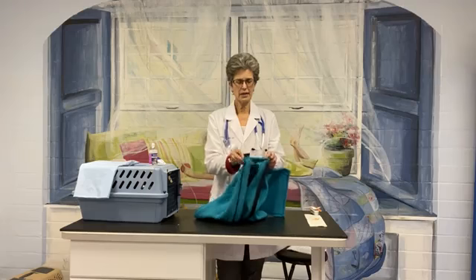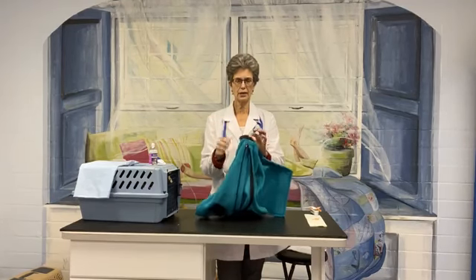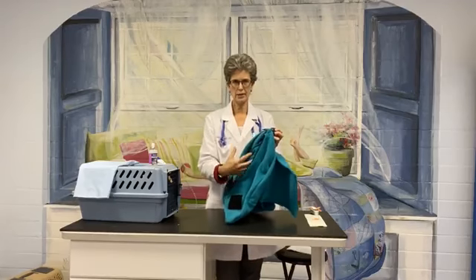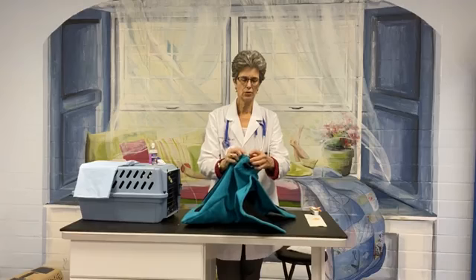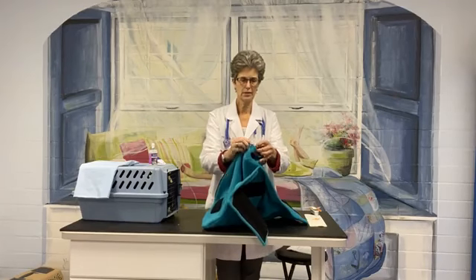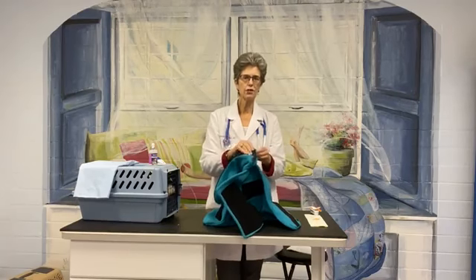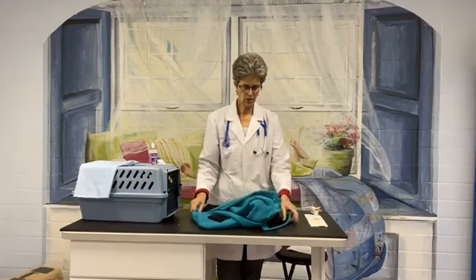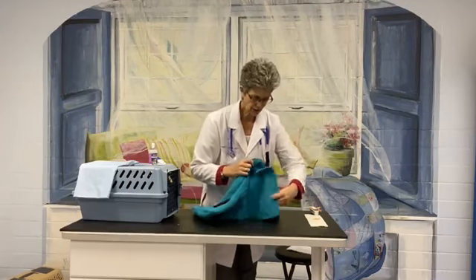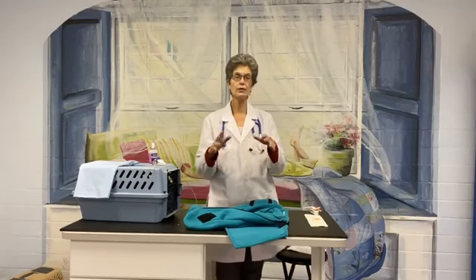You'll see when I put it on Binks, this Velcro band here first goes around the neck, and we'll have him sitting or laying in here. And then it's a separating zipper at the top, like what you might have on a coat. So you will have to put the end of the zipper in there to start it up. To make this best for the cat, you are going to have it open, like so, laying flat on the table or maybe the floor, to make it easiest for the cat to get in here. And that's really a big point.